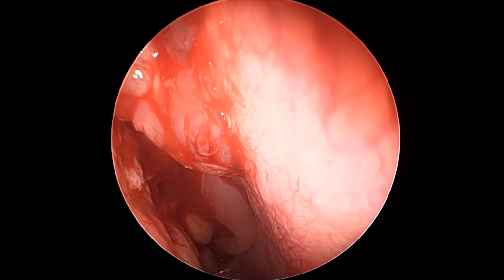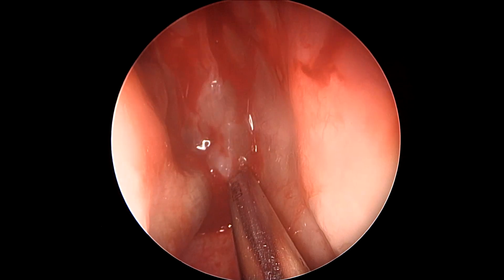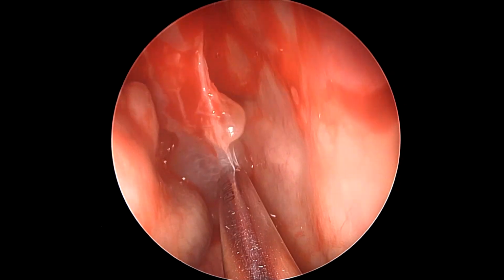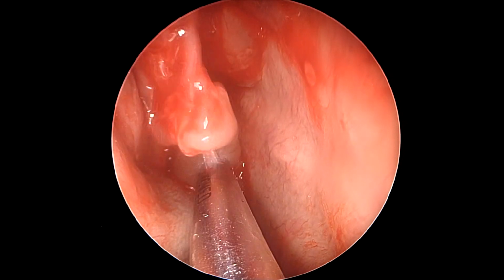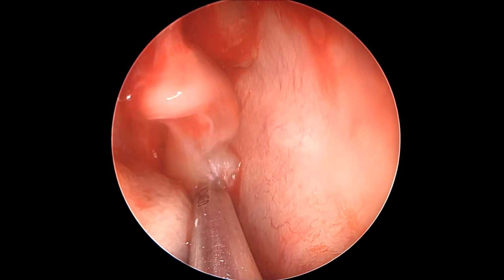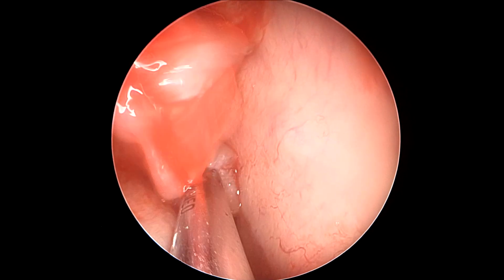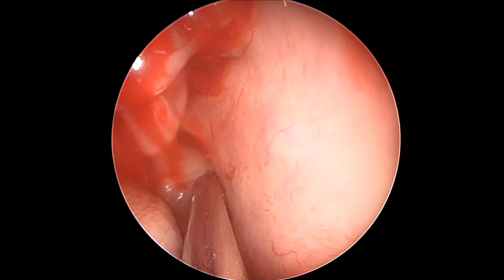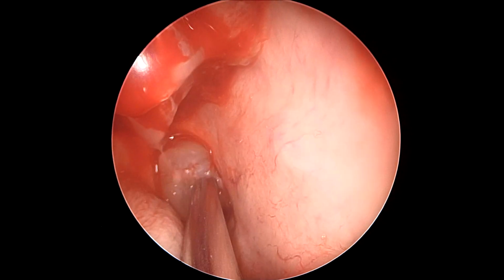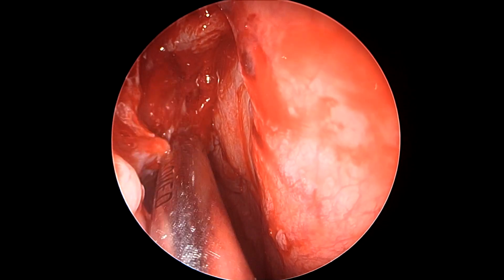Once completed, we can use the same instrument or a curved suction to enlarge the antrostomy downwards. Before that, it may sometimes also be prudent to remove some of the polyps that fill the choana and the nasal cavity to get some space in the posterior nasal cavity for observing the choana. The choana happens to be a very important landmark in sinus surgery, whether it is primary or revision, and helps orient the surgeon even in a bloody field as to where the approximate location of the sinuses is.